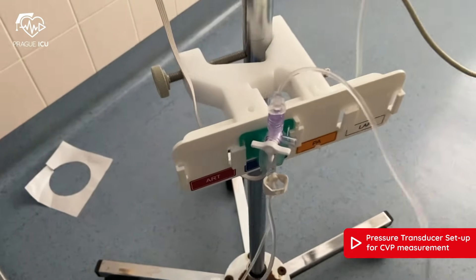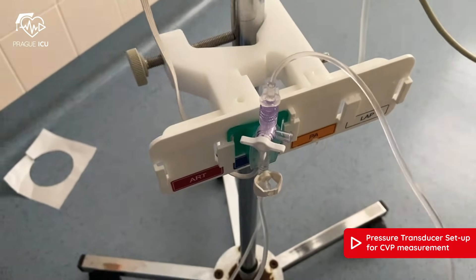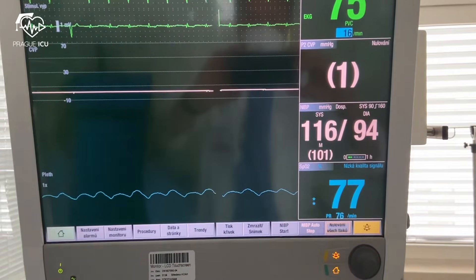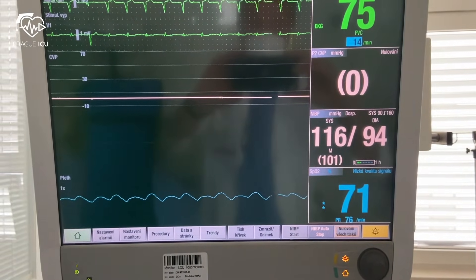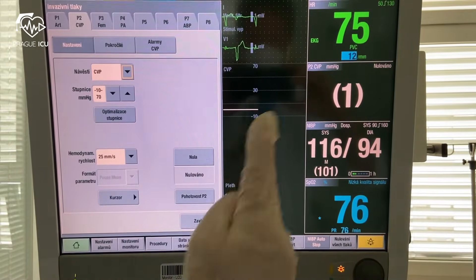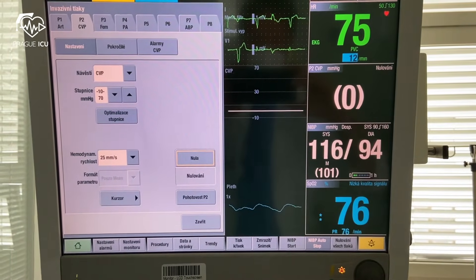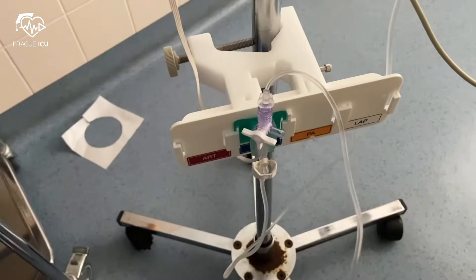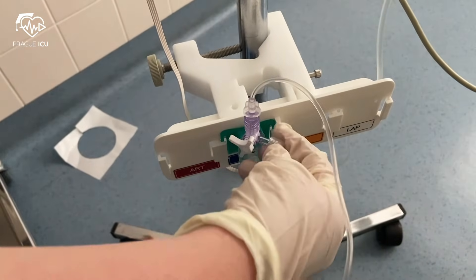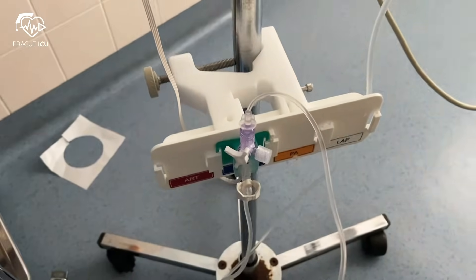Close the stopcock towards the patient and open it to atmospheric pressure, as seen on the video. Press zero on the monitor and wait until the actual zero appears on the screen. Then turn the three-way stopcock back to its starting position with the closed cap, and you can begin your pressure reading.